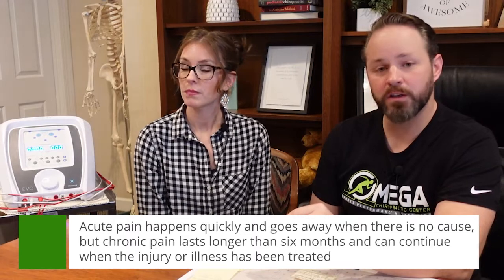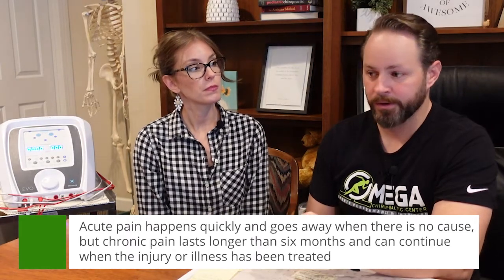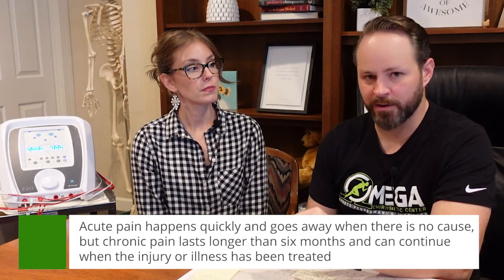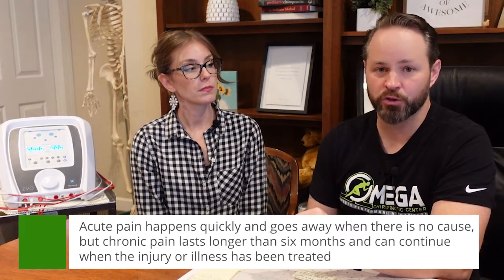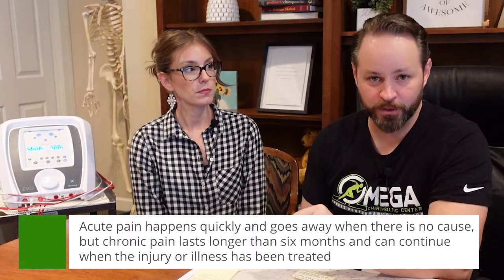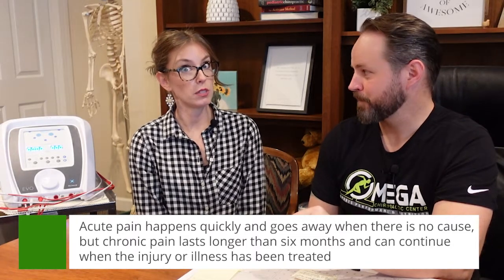Or you have the fun chronic issue. Say like our parents, my dad, he's a truck driver. He's sitting a lot and he has chronic hip and lower back pain. It's been going on for years. He's too darn stubborn to do much about it. So we would do both for those. Maybe a different setting. That's the beautiful thing about the technology, but it feels for the most part the same.